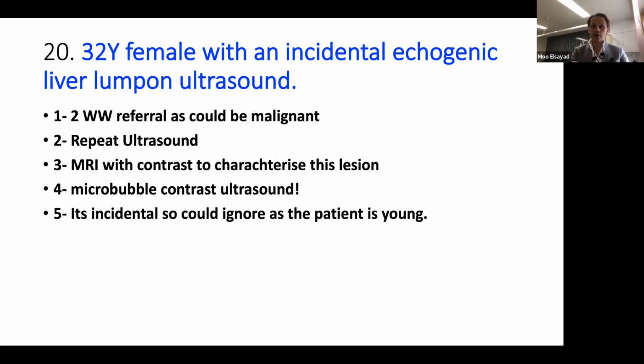You know that, with any echogenic incidental lesion, so it's incidental. It's not a patient who's known to have cancer, not a patient known to have weight loss or anything like this. Incidental, went for pain, found this lesion, and now we got distracted by looking at this lesion and forgot about the pain, as we always do. And then the patient will be anxious till the MRI scan, waiting time is longer, and all the story. We want to help the patient, help you to get this right. So community sonographers will not request it because they don't know about it. And now you know about it. So I'm sure you could use this to your advantage now.